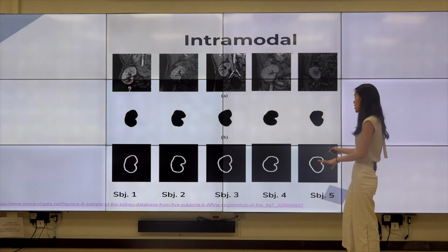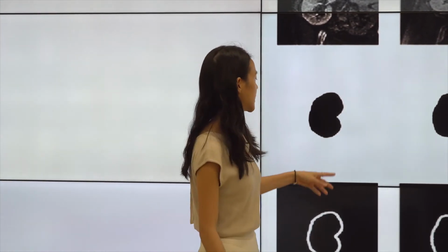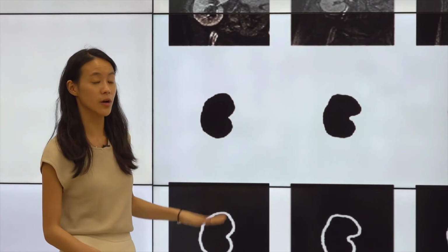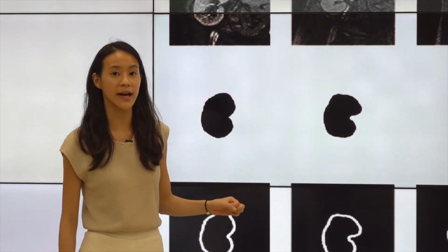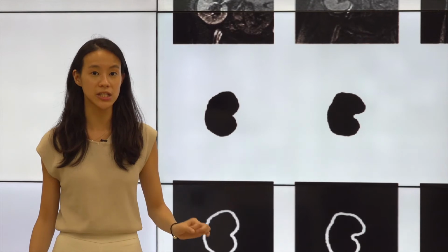So through scaling, through rotation, through all these different processes that we're going to talk about later, it would make a physician's life a lot simpler when they're trying to compare, for example, where the tumor is growing. Let's just say there's a tumor that was growing here. In order for the doctors to be able to compare this with the remaining patients, whether or not that tumor is growing there, would require a registration process in order to immediately identify how off that tumor is in terms of positioning in each of these patients.